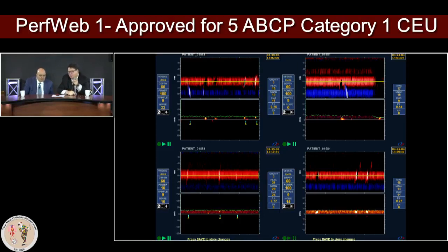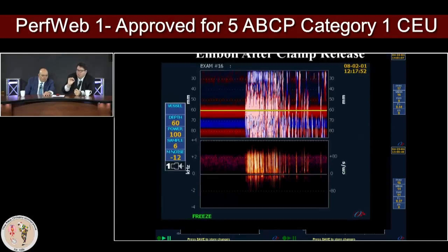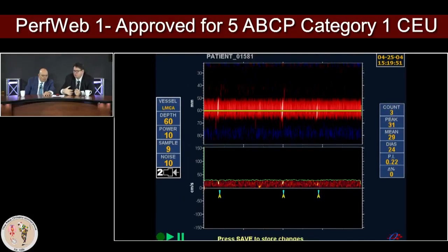But definitely what I'm really scared of is the left upper corner. See the left upper corner materials? They are deleting your embolus signal. They are deleting also your blood flow signals. Yep, I see the gap. These are huge gaps. These are huge chunk pieces, and we are lucky that we still have a flow after them. So this is where we definitely need to pay attention to all those tiny details, not just the big shower of emboli, but this is a good example.